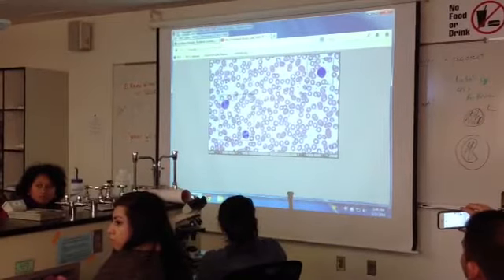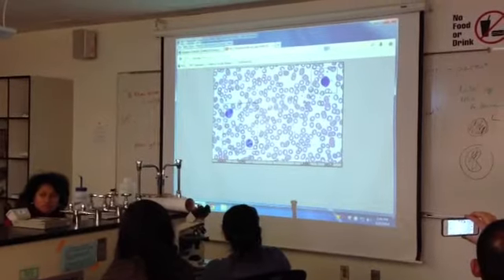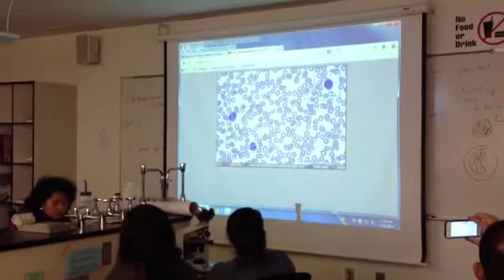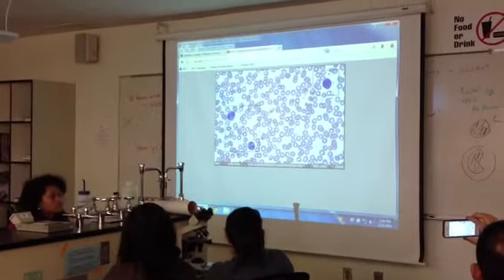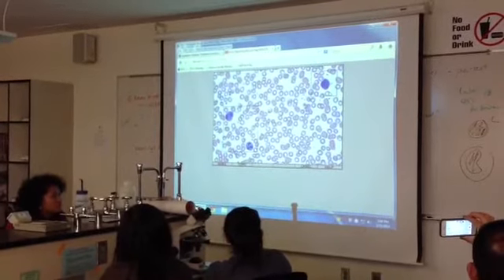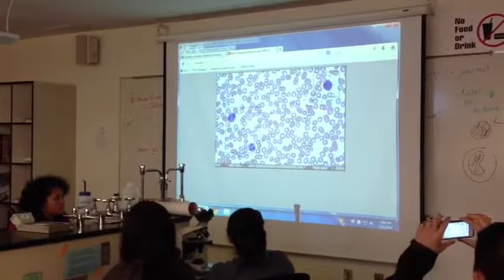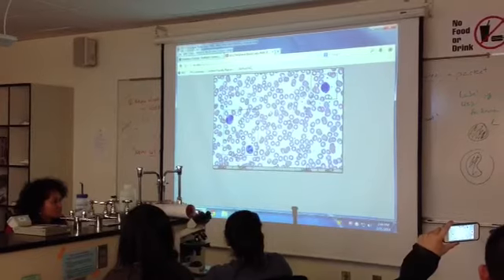Without sounding like a complete smartass, what is the importance of knowing the distinction between these different cells? Someday, when you work as a pathologist in a hospital, you can tell what infection people have. If you have worms, your eosinophil count goes up. If you look at a slide and see eosinophils are up, you can say the patient has worms. If the basophils are up, you have an allergy. So knowing the different cells when you see them tells you what's wrong with the person's immune system.